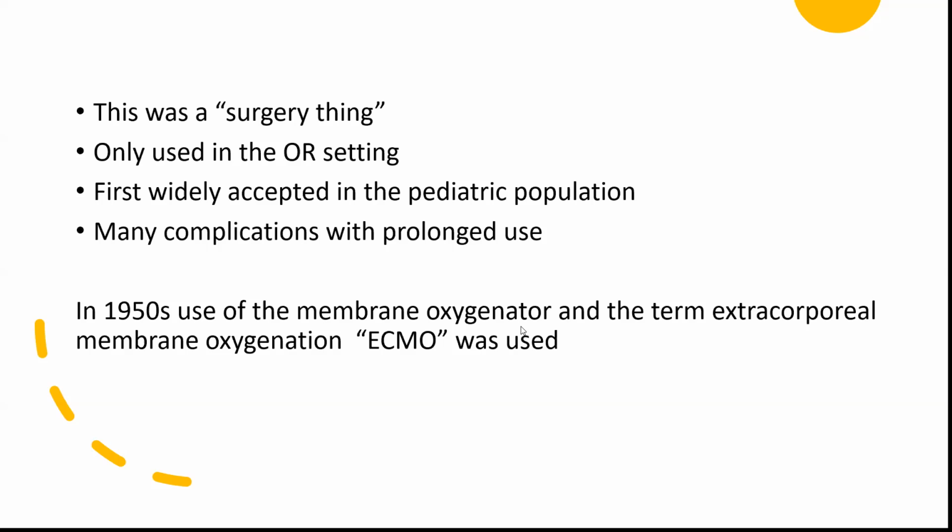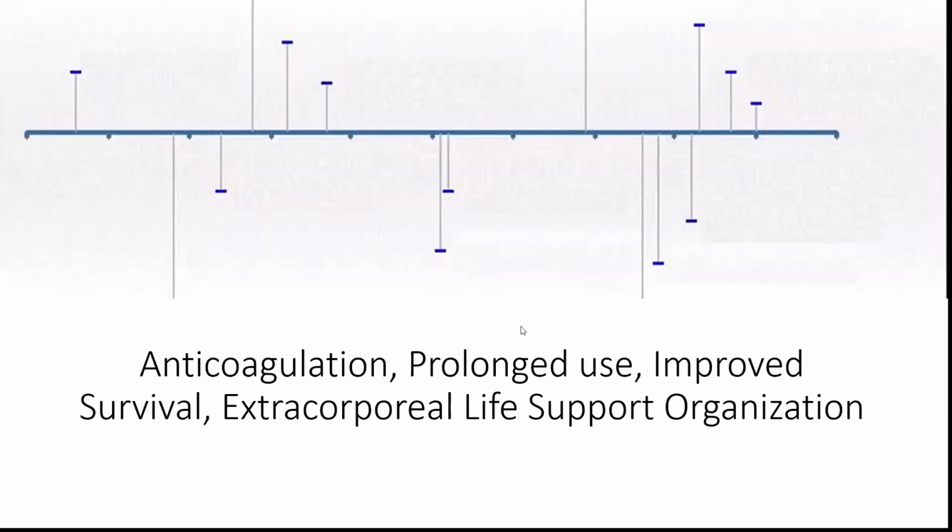And then if you're ever looking into the history of ECMO and you look back before the 1950s, you may see more so ECLS, because ECMO wasn't coined until the 1950s when the membrane oxygenator was used. And that's when you'll see it used more continuously in the literature. So between the 1950s, 1990s, early 2000s, ECMO had a lot of advances.